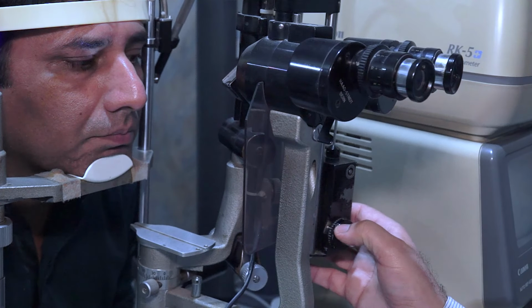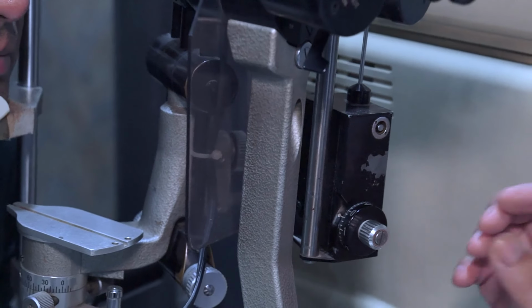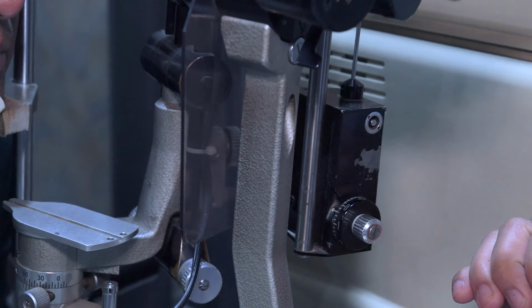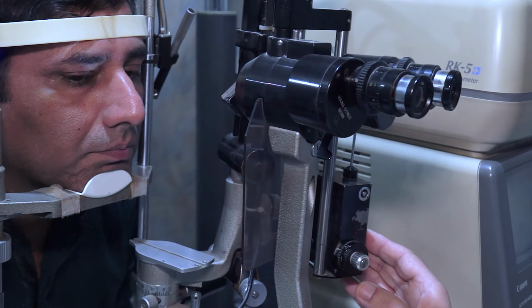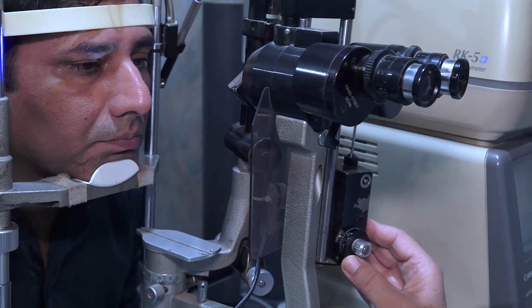So the first graduation, which is 1, means 10 millimeter of mercury, and the small graduations are equal to 2 millimeter each. That means 14 millimeter of mercury is the intraocular pressure of this patient, which is equal on both sides.